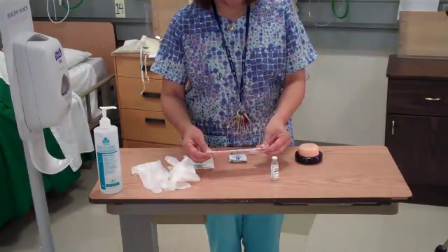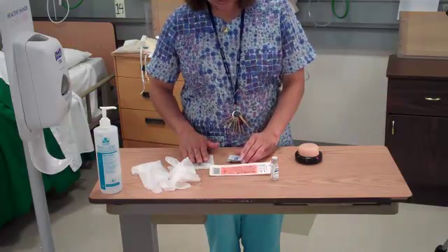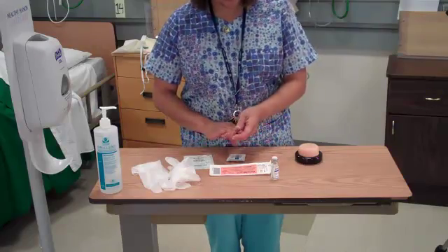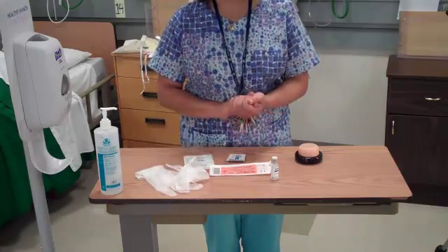Today I'm going to teach you about a sub-Q injection. I'm going to go ahead and gather my supplies. I have a 2x2, some alcohol wipes, I have my medication, and my insulin syringe. I have my gloves and my hand gel at the bedside also.